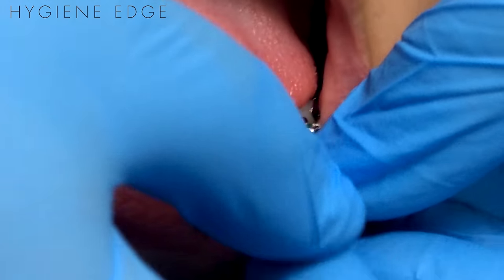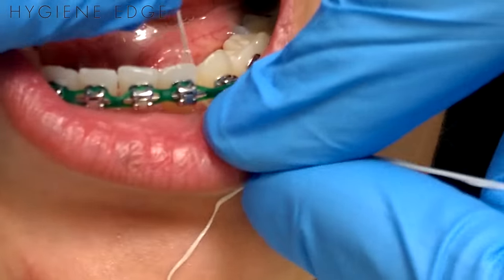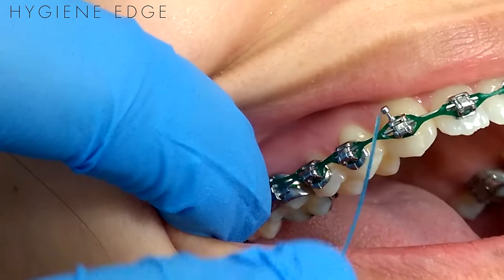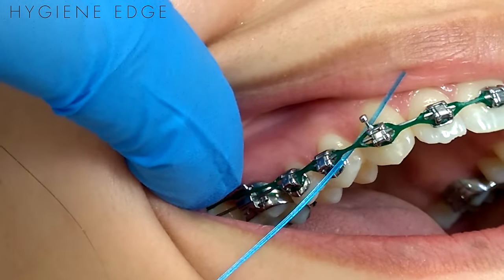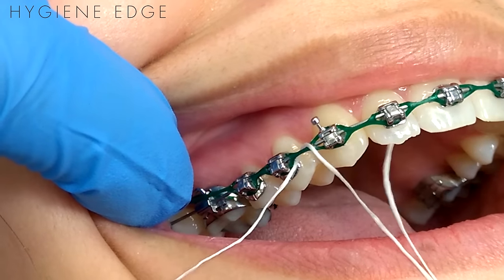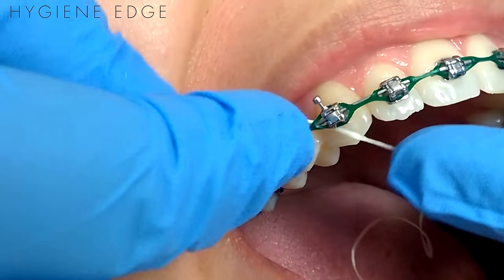Especially in the molars — but I'm going to show you up here on an anterior to make it a little bit easier to see. I like to floss between the teeth, and then if I can't reach with my fingers because it's really tight, I'll grab a cotton plier and just help pull it through. Then you're just going to floss as you normally do with your C-shape.